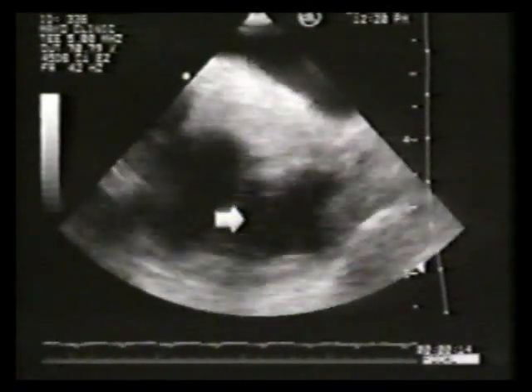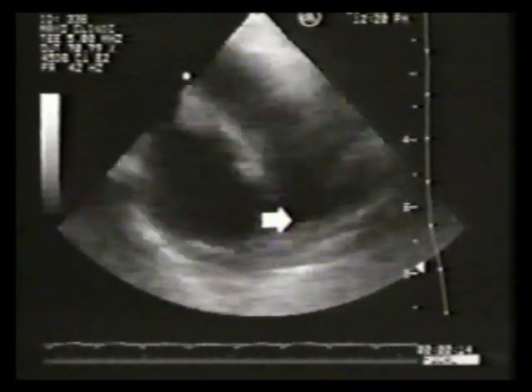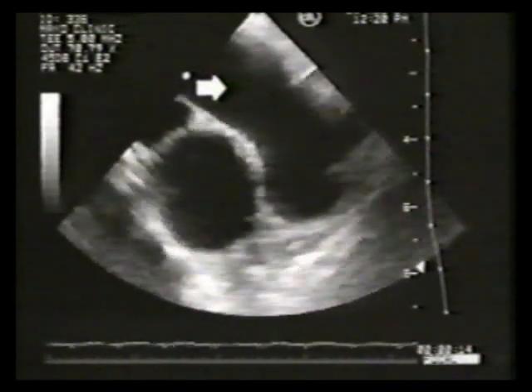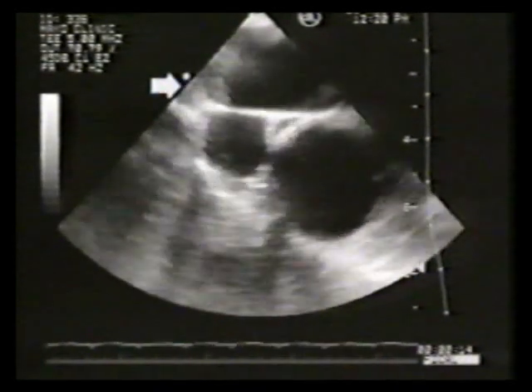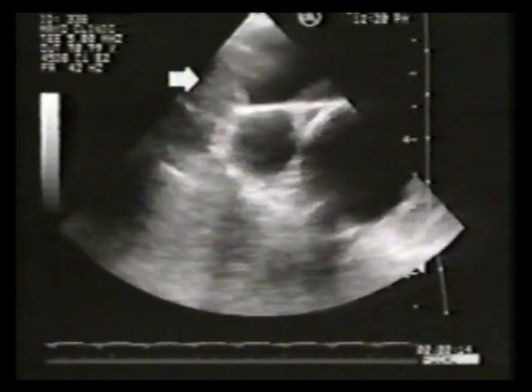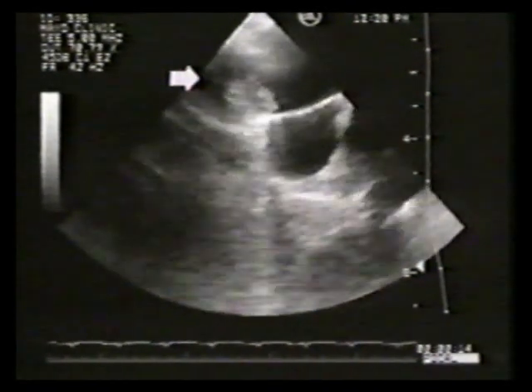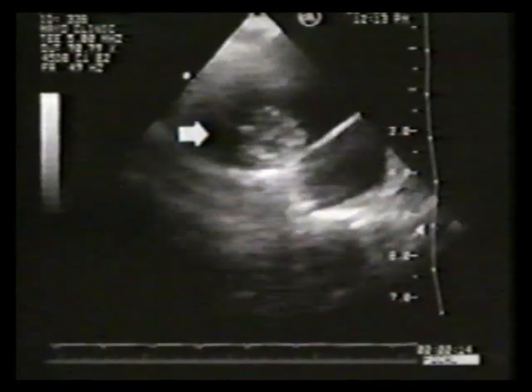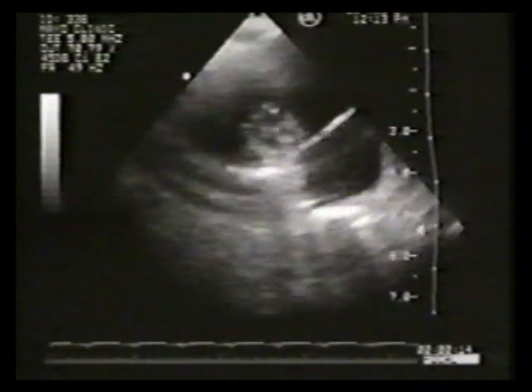On basal short-axis views of the aorta and pulmonary artery, progressive anteflexion of the transducer allowed imaging of the right main pulmonary artery. As this scan was carried to the patient's right, notice that there is a mass in the distal right pulmonary artery just posterior to the superior vena cava. Investigators have reported the utility of transesophageal echocardiography for the visualization of proximal large pulmonary emboli.